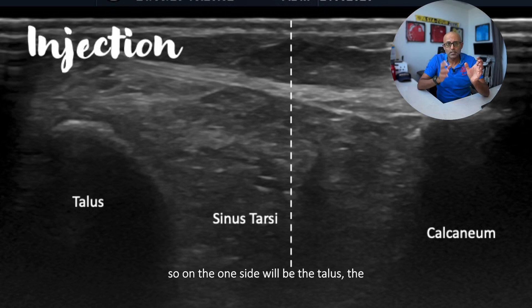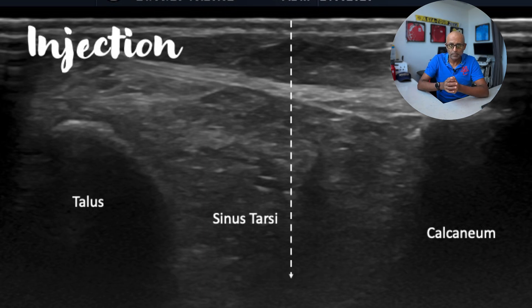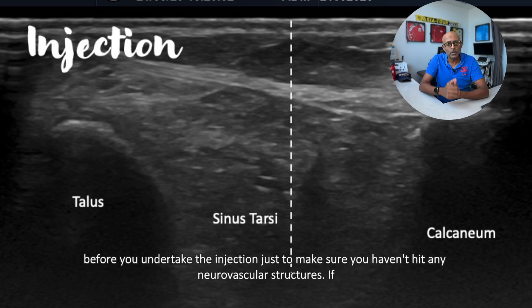On one side will be the talus, the other side the calcaneum, and in between will be your access point for the sinus tarsae. The needle should be seen going directly down into this space.